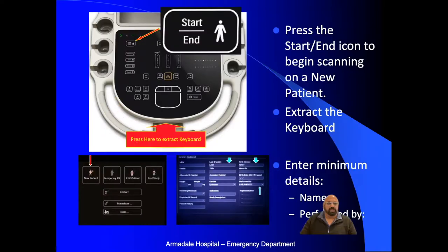Moving on, the first thing you want to do is press the start and end button. To input any text, on the side you'll find a button that releases a spring-loaded keyboard tray. Press that and the keyboard tray comes out where you can use the keyboard to put in details. Once you press start, the new patient button is used. The minimum criteria we ask is that you enter the patient's last name, first name, and the person performing the scan.